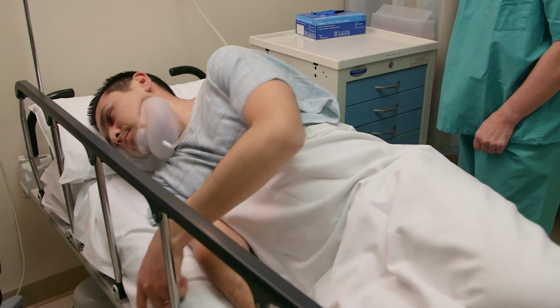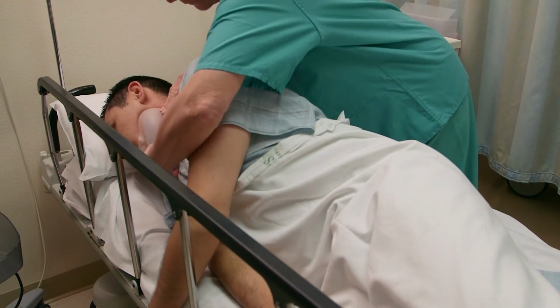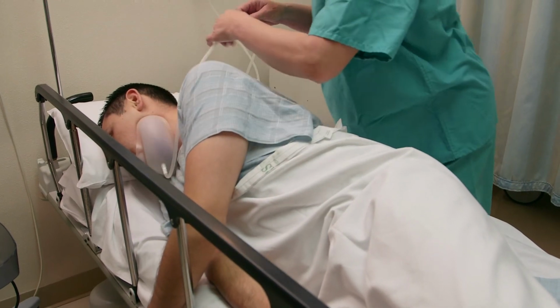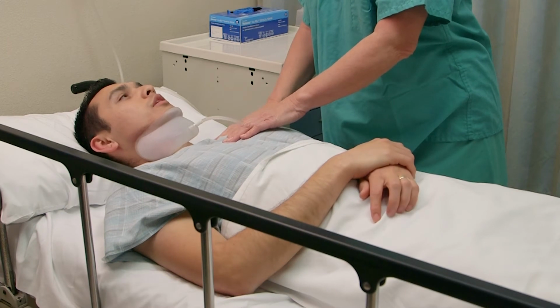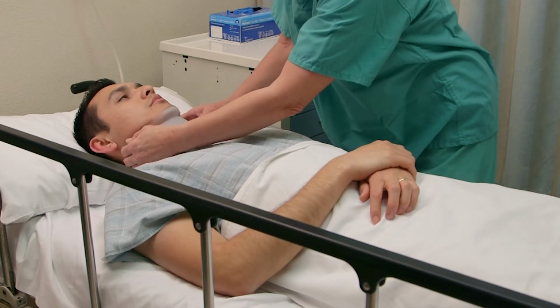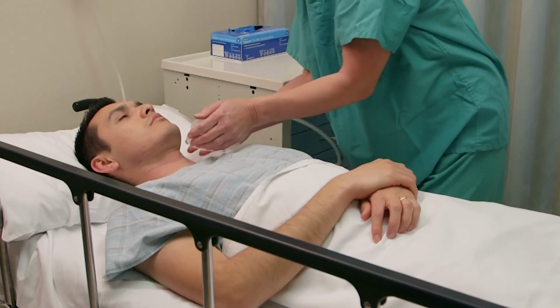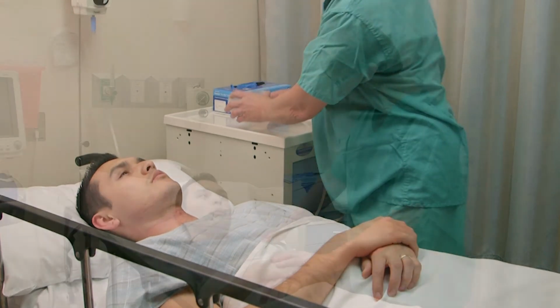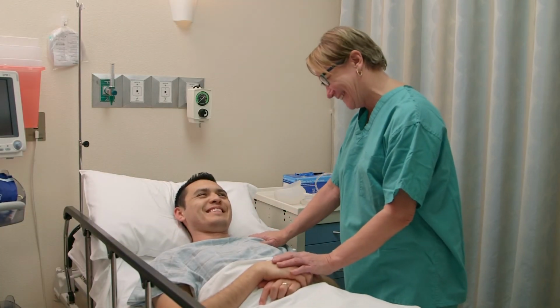If a patient is repositioned while using aerFree, verify that the vacuum gauge continues to read -45 and that the collar is not dislodged. At the end of the procedure, after the patient is no longer at risk of airway collapse, the collar may be removed by simply lifting up one edge of the flange and peeling the rest of the collar off. The collar should be discarded in accordance with your facility's policies.